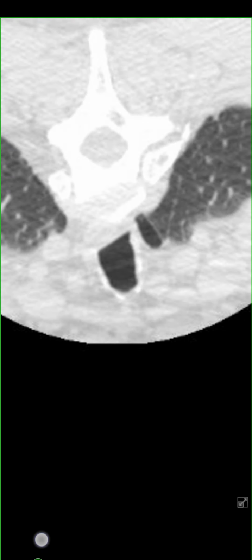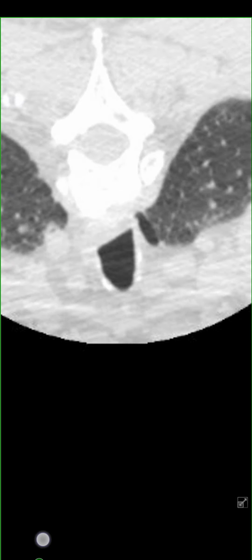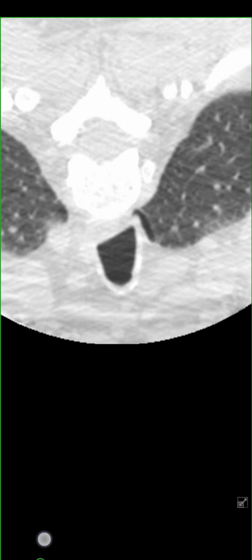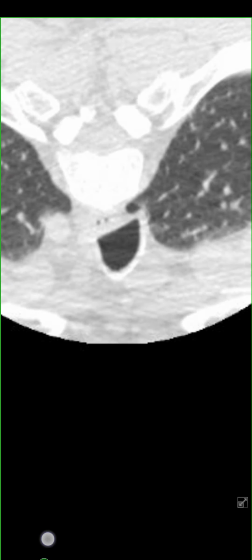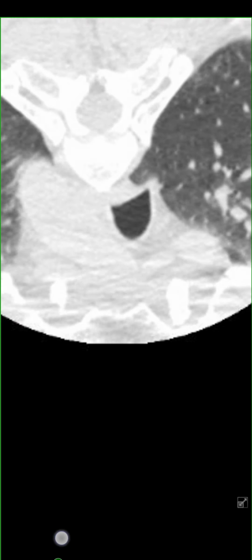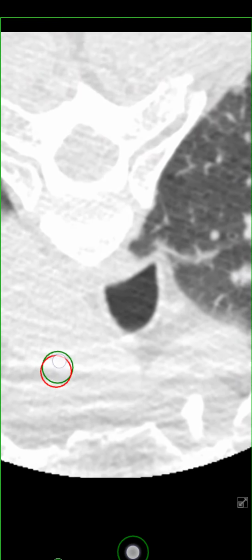This is highly uncomfortable, but you can see the second bubble of air tracks right to my spine, where I've had multiple blood patches and CSF leaks that have been documented. Not only does it track to my spine, but it curves around behind my trachea, between my trachea and my spine, which is extremely uncomfortable and gives me a sense of extreme pain. And it tracks all the way back around to the air that you see in my esophagus. And I can blow it up a little bit better so you can see it better.